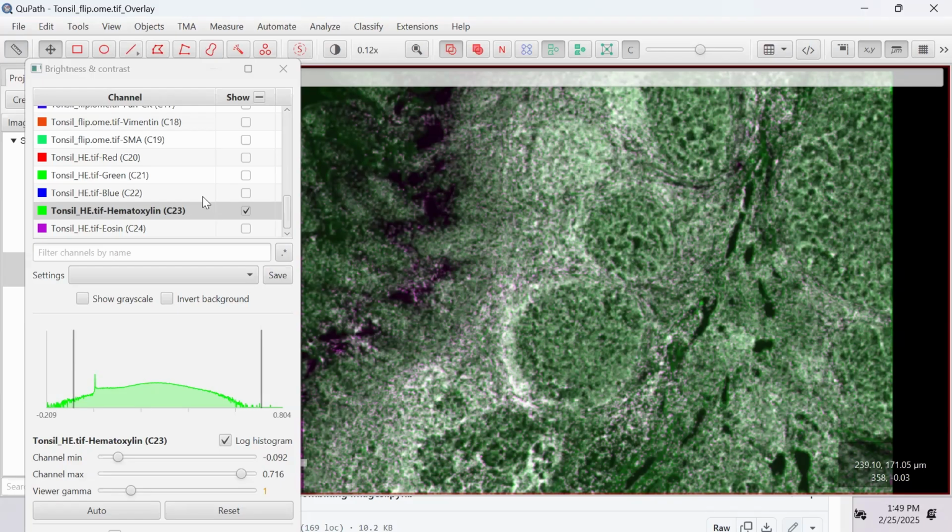Sometimes you may want to have a fluorescence image and you want to maximize the amount of information that you can get from it. The whole pathology was built with H&E images and different kinds of classical histological stains.